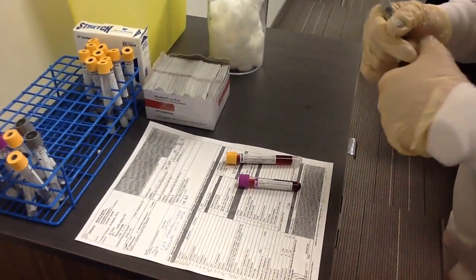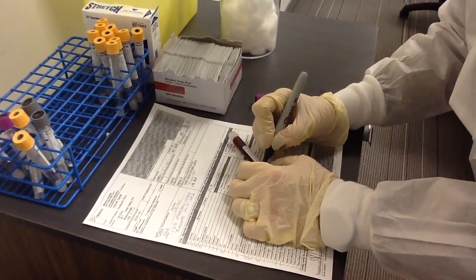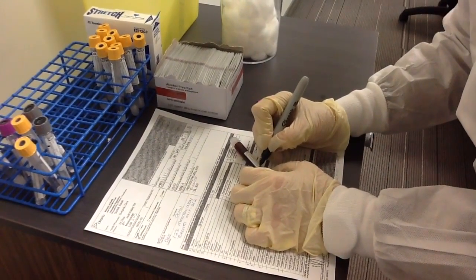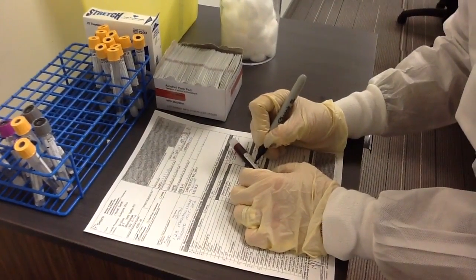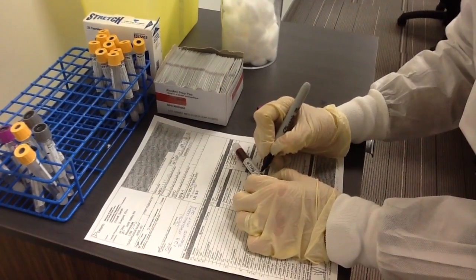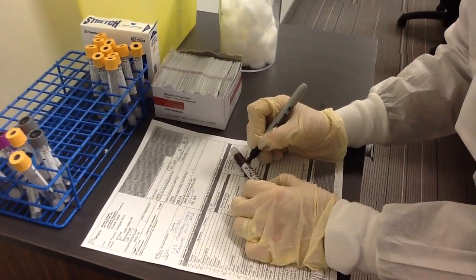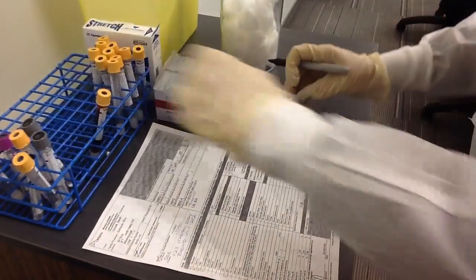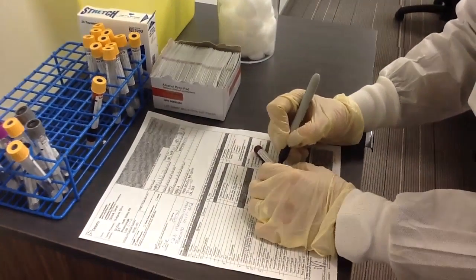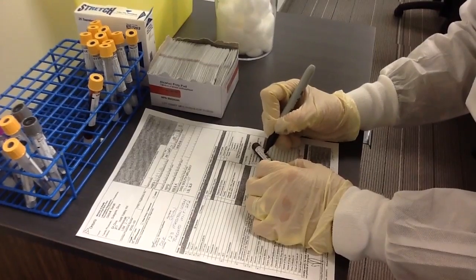When you have completed the collection, label your containers. Confirm all labels match the information on the requisition form by checking the two unique identifiers. Place labels on the specimen containers correctly. The labels cannot cover the expiry date, should not be wrapped around the bottom of the tube or create a flag along the side. Leaving a window to see the sample inside the container is also recommended.